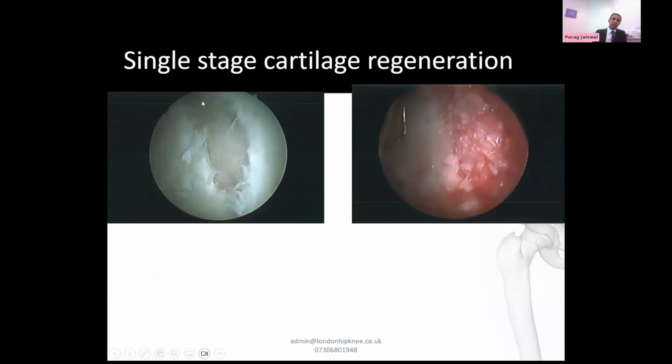Once I pinned the labrum back to where it should be, you can see this mass, well, it wasn't massive, it's about 2 centimeters, and a depth of about 0.6 centimeters defect of cartilage. What's important here is that although this is the defect, once you debride unstable cartilage here, the defect becomes bigger. And it's important to do that step, otherwise this will progress.